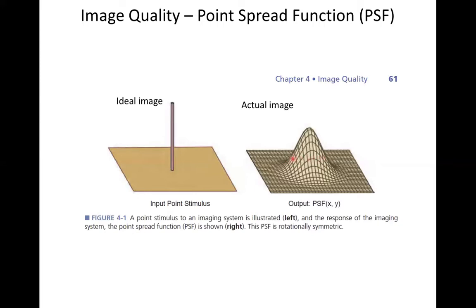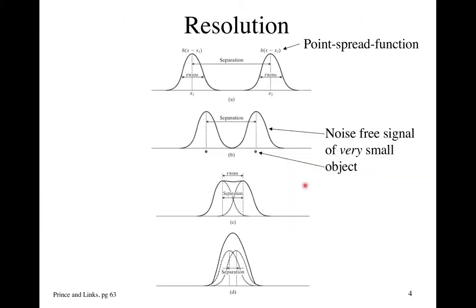And so characterizing the spatial resolution of your system with that function is complete, but you can also, if you know the functional form of the point spread function, let's say it's a Gaussian, and we'll look at what that means, you can give, say, the full width at half max, and that gives the entire description of the point spread function if you know its underlying analytical form. So this is often used to characterize images or imaging systems and how much they blur a signal.